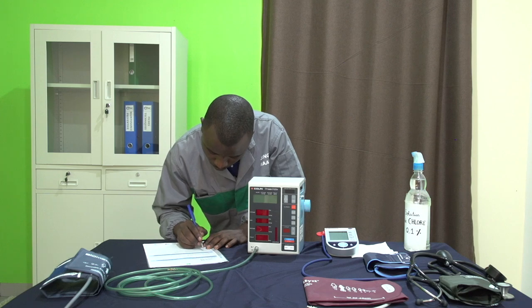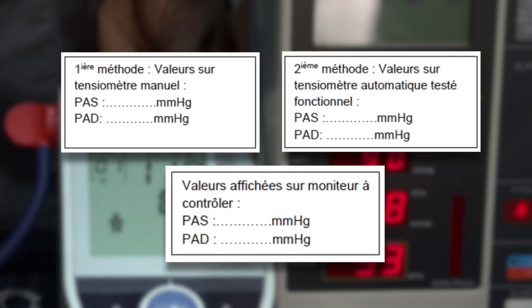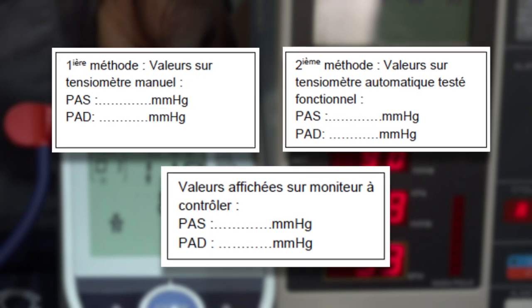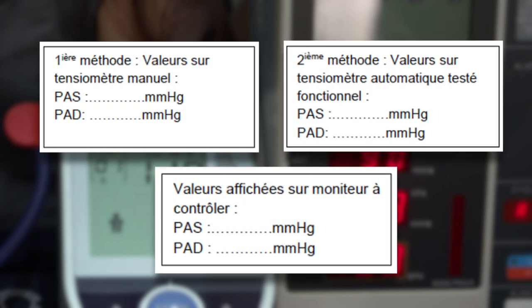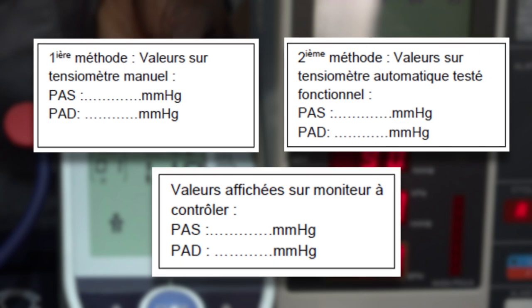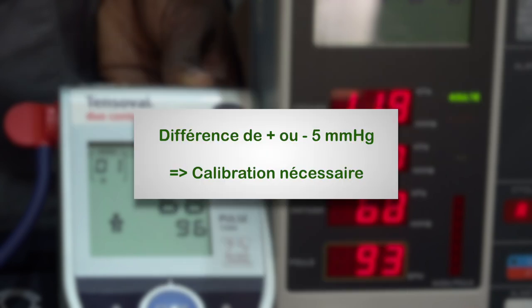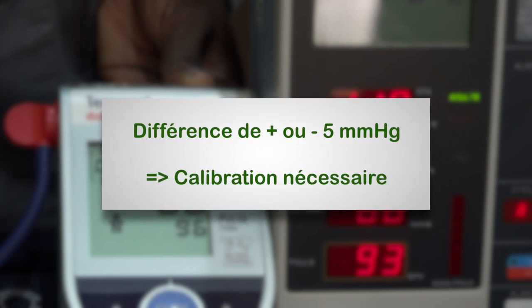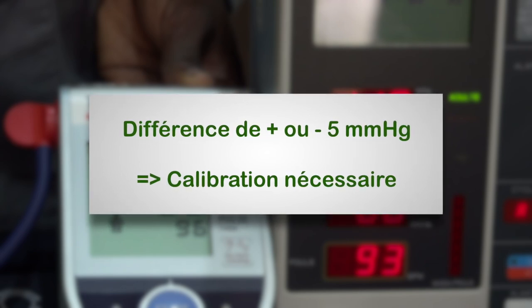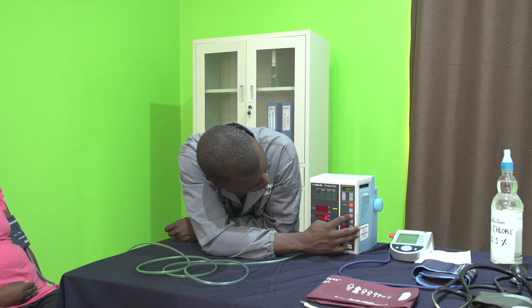On note les deux valeurs mémorisées sur le compte-rendu du test. Ensuite, on compare les mesures de la première ou deuxième méthode aux mesures de notre tensiomètre que l'on teste : on compare les valeurs des pressions systoliques entre elles, puis les valeurs des pressions diastoliques entre elles. Si la différence entre chaque valeur est supérieure à ±5 mmHg, cela signifie généralement que notre appareil a besoin d'être calibré, opération que l'on peut effectuer avec la documentation technique de l'appareil.